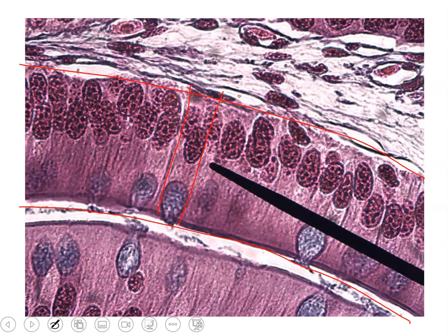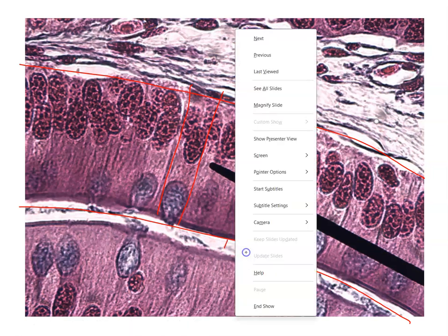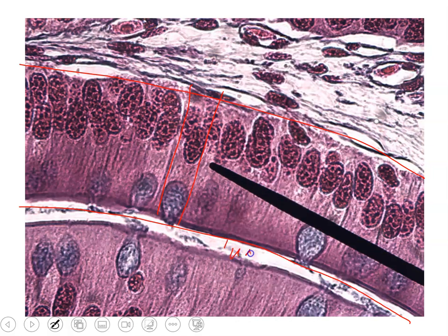It's upside down because I know this is the lumen right here, that space where the apical surface opens up. So simple columnar epithelium, beautiful goblet cells you can see opening up to the apical surface. And look at the nuclei just line up in a row. And the beautiful columnar cells that are taller than they are wide. So we have simple columnar epithelium.